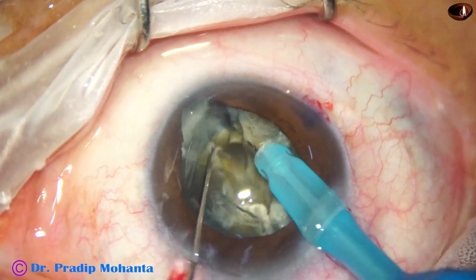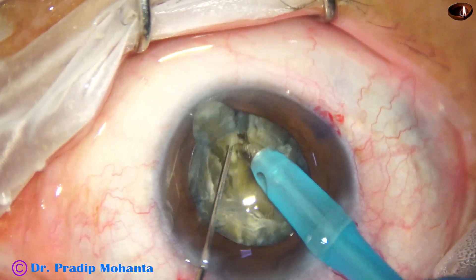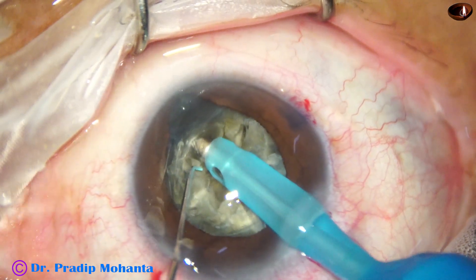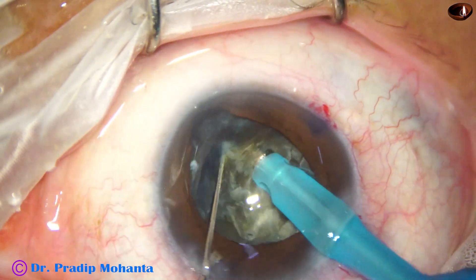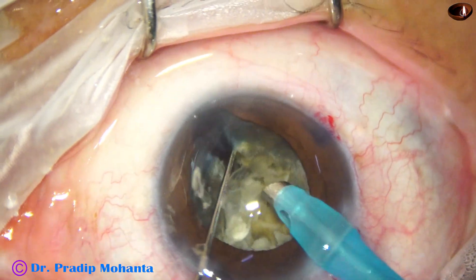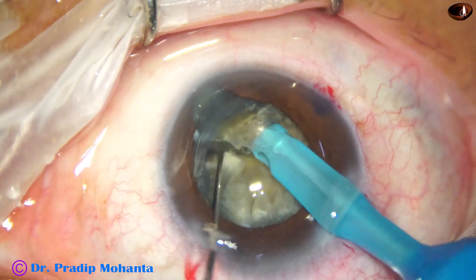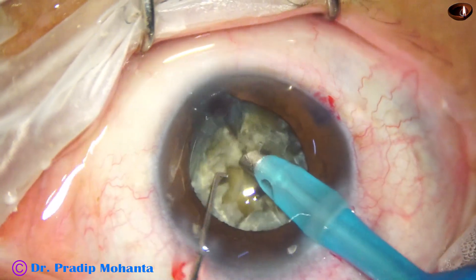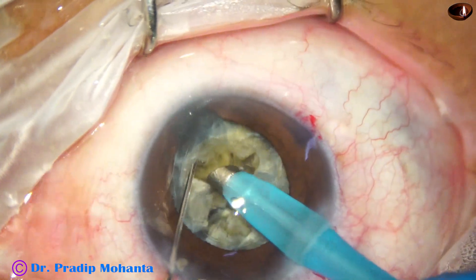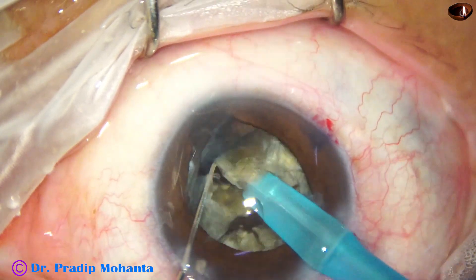So I emulsify the central endonucleus. Till now I have not got any free nuclear fragment — and this is a free nuclear fragment. I go another round, hold the pieces, and go on separating. And I have been able to separate all the pieces.